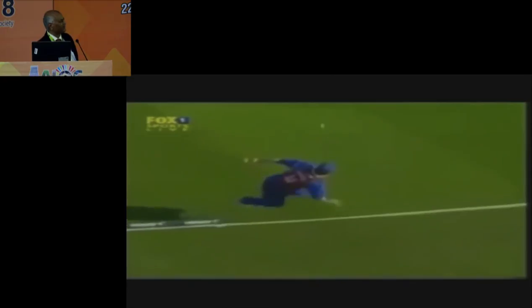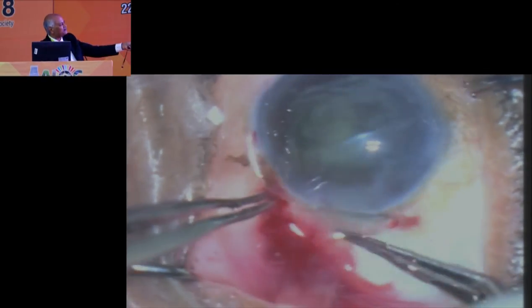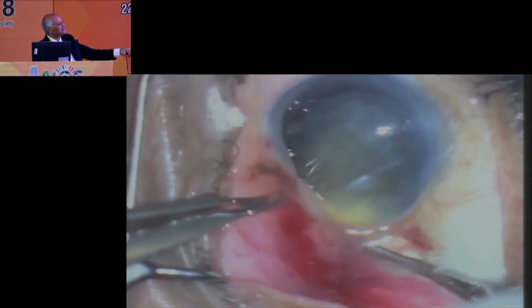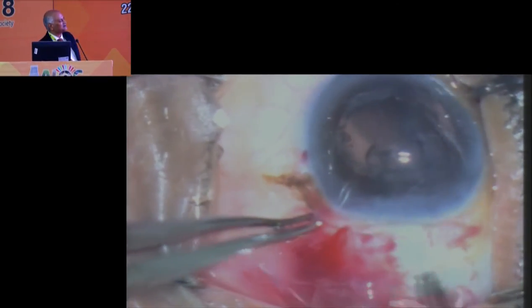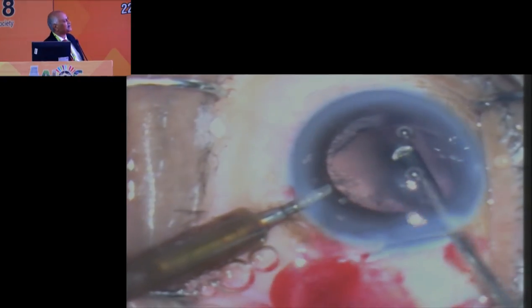I have held the nucleus, and once I have held it, see like this, I have caught it, and it was to go out, and there is a glide. I do the Blumenthal technique. So by the glide, see now the nucleus has come out. It was supported by the glide. But you should not go much behind. And now here I am doing.